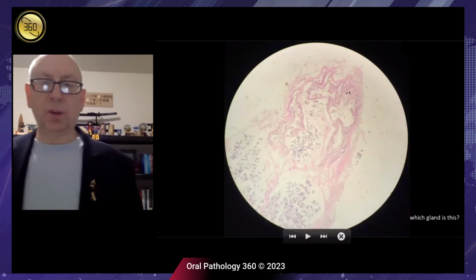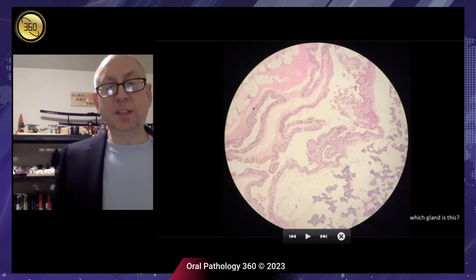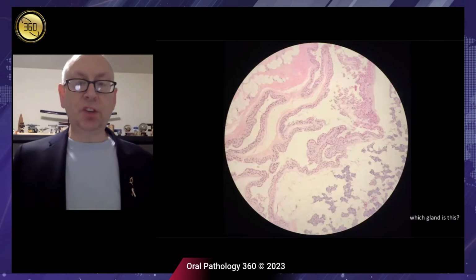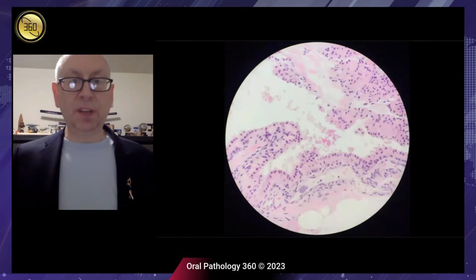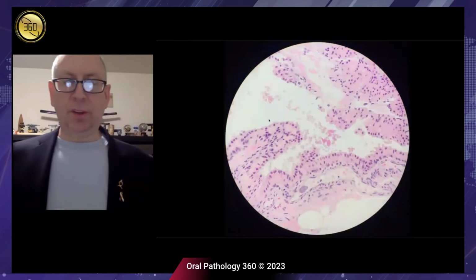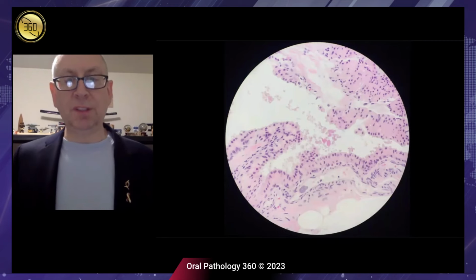So the third mass we're going to see looks kind of cystic, but now what I'm seeing is a different kind of cytoplasmic and nuclear characteristic. I'm seeing much more of a columnar type cell feature. I'm seeing much more of an oncocytic or oxyphilic characteristic to it. And now I start seeing this pseudostratification, and it almost looks like respiratory epithelium. But the nuclear features are fairly innocuous. They're fairly bland. The nuclei are small compared to the cytoplasm.